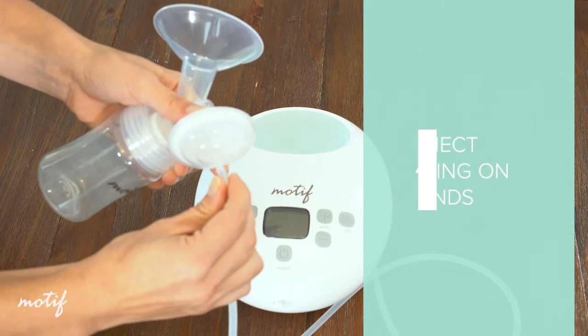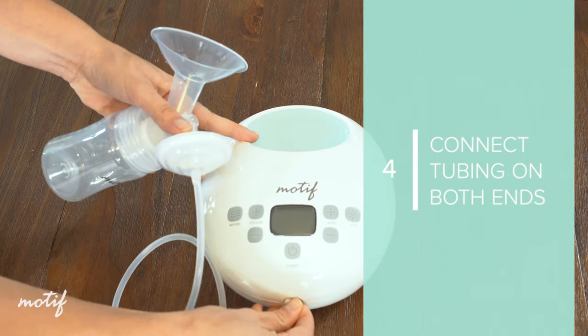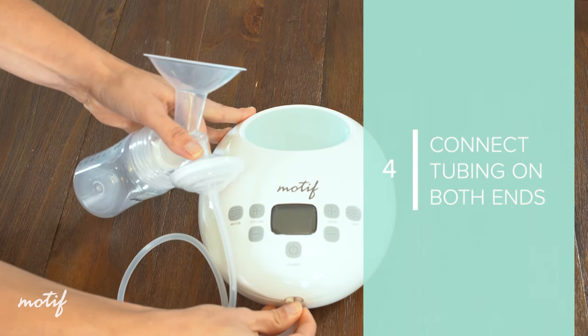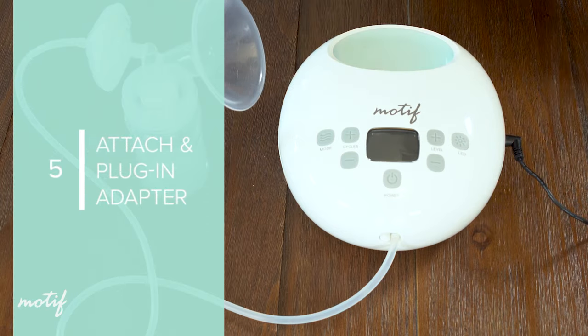Connect the tubing to the diaphragm assembly and connect the other end of the tubing to the Luna. For single pumping, attach the cap on one of the airflow ports. Plug the power adapter into the Luna and plug into your outlet.